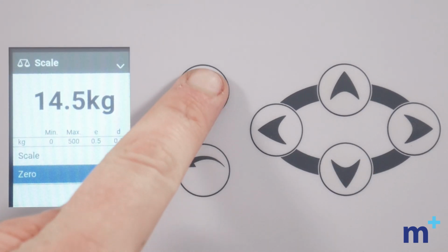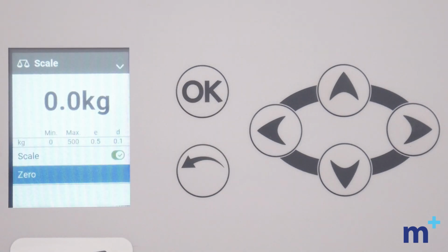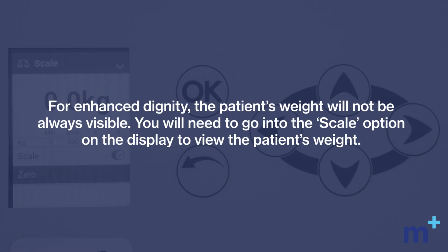Press OK on the 0 option to reset the weight. Once the weight has been reset, the patient can be placed onto the bed. For enhanced dignity, the patient's weight will not always be visible. You will need to go into the scale option on the display to view the patient's weight.